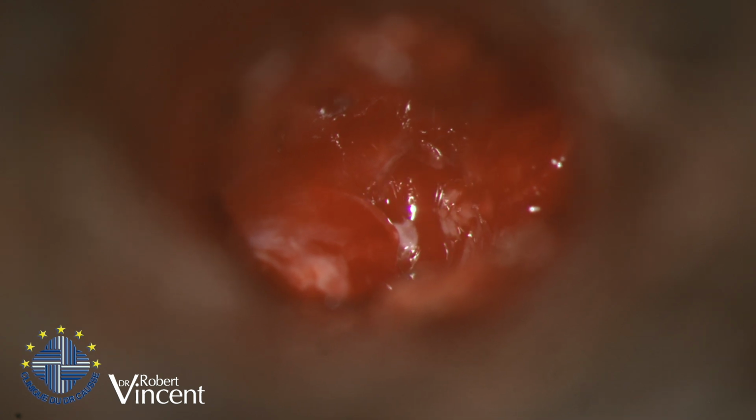Because it's too inflammatory. If I put a Malleus prosthesis, I think we need to stage. Tympanosclerotic stapes, ankylosis, I think it's more tympanosclerosis here. You see, it's pure white.